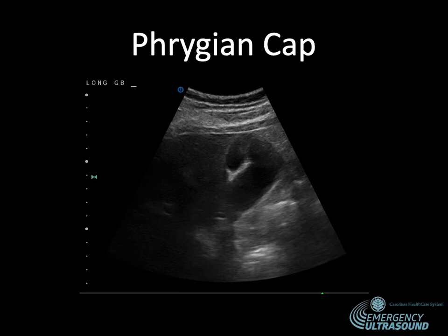And here's just a still clip of it. We can't really appreciate it well here. You can a little bit, but it's just a folded over gnome's hat gallbladder. That is not pathologic. It is just a finding in some people, but a little bit more fun finding.